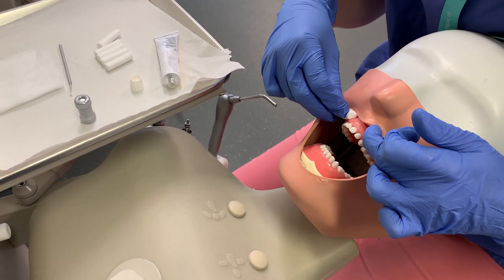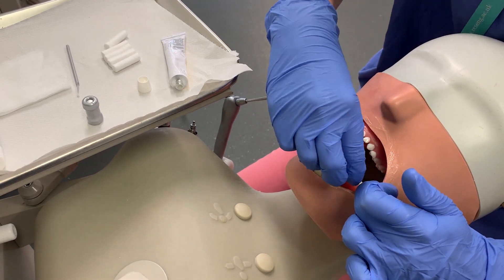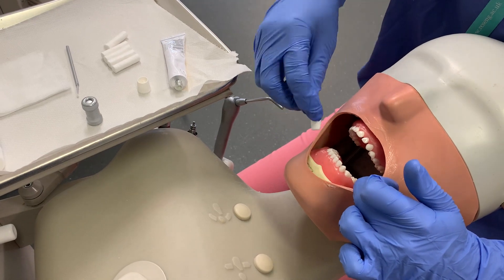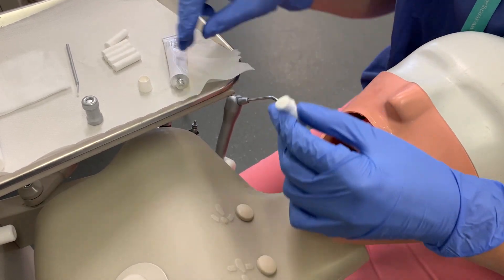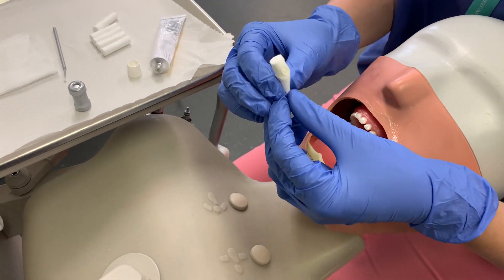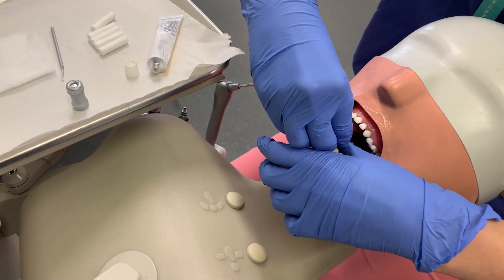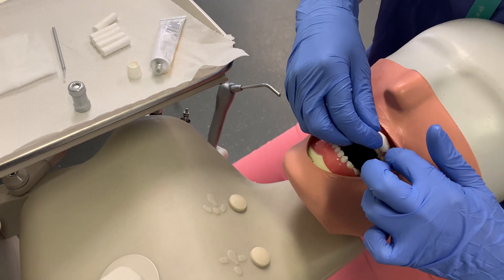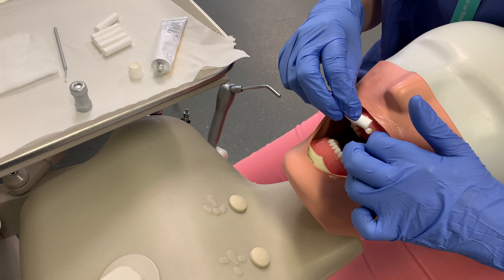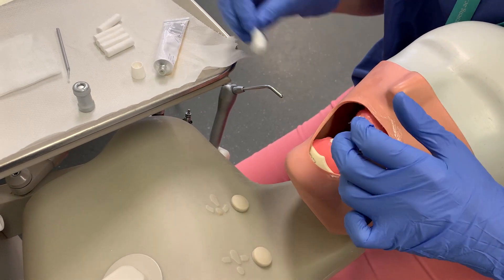You also want to use that Vaseline as a soft tissue barrier on the gingiva. Now the Revastar kit does actually come with a gingival barrier, which is like a blue paste that you syringe out onto the soft tissue next to the gingiva and then cure. But that requires a bit more cooperation, so if you've got a little kid, Vaseline is sufficient if you can't manage with something else.